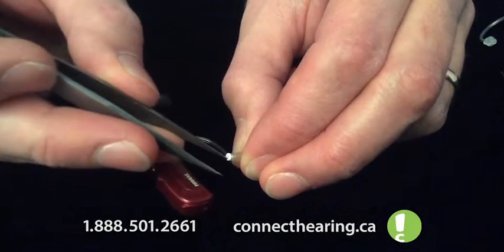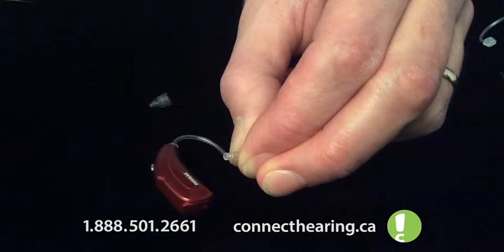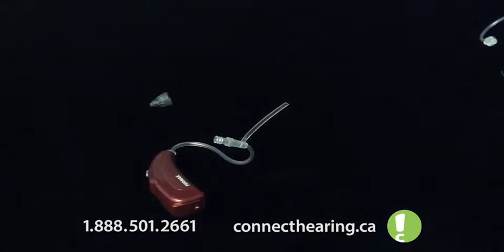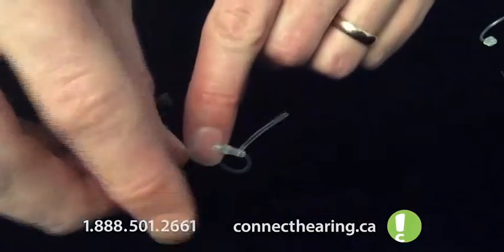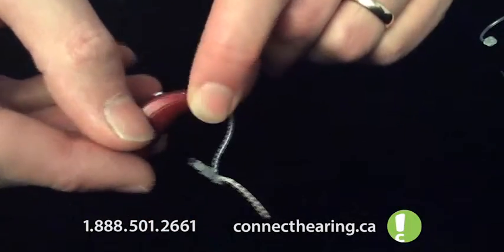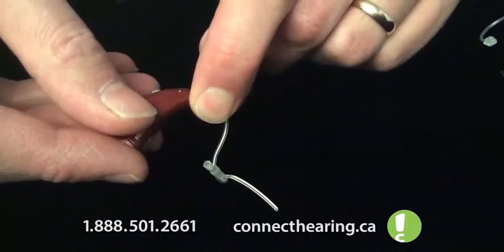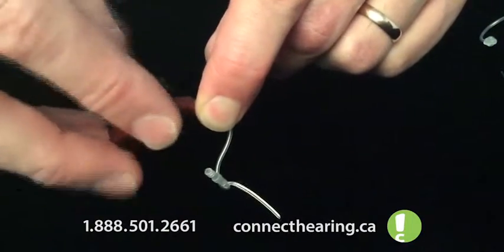Sometimes the tips can be in there a little bit harder than others, so I've got my tweezers here. And this is something that may happen to you at home. Now while I've got it out, before I put the wax guard back in, I'm going to unthread the tubing from the hearing aid by screwing it counterclockwise.